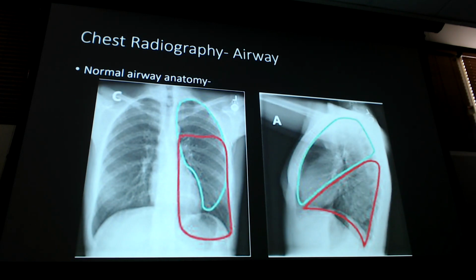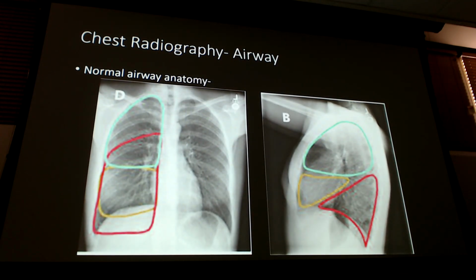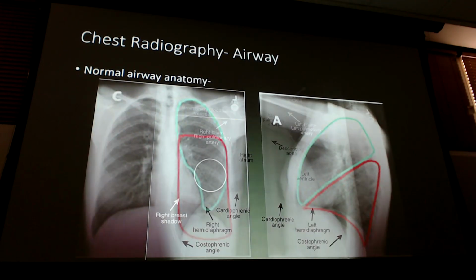Same thing on the left side. I don't know why they call it an upper lobe. It expands the whole dang chest. The same thing, but look how high the lower lobe goes on that PA. Significant overlap. So really, anything not in the tippy top, even the bottom, is questionable, right? The tippy top, you're like, I don't know what lobe it's in. You go to your lateral, there's a clear delineation between the two. Right? So just look at all those. We'll go over things in those areas and pinpoint those lobes as we go through it.